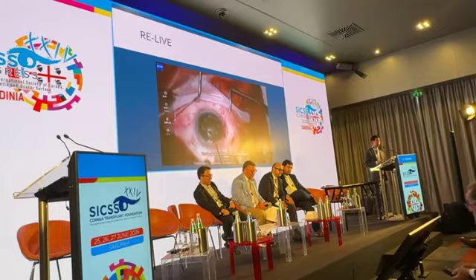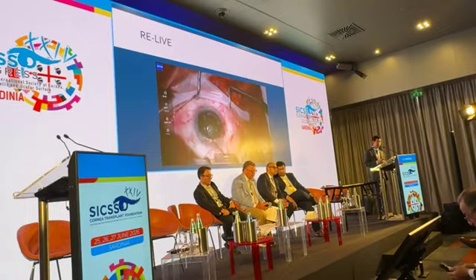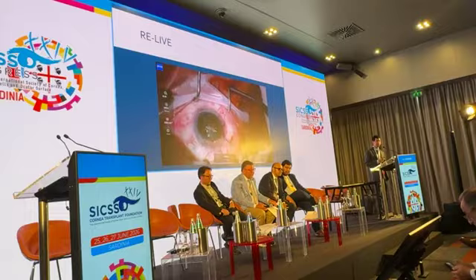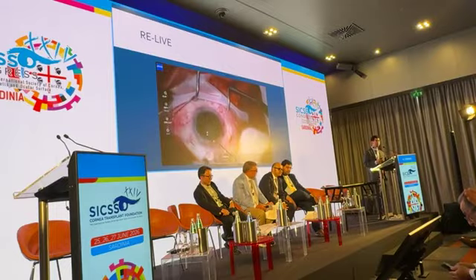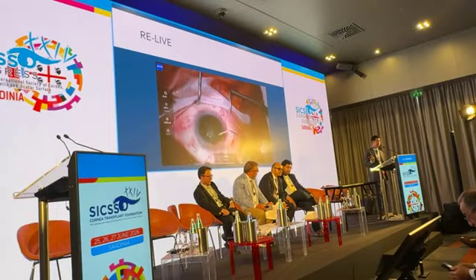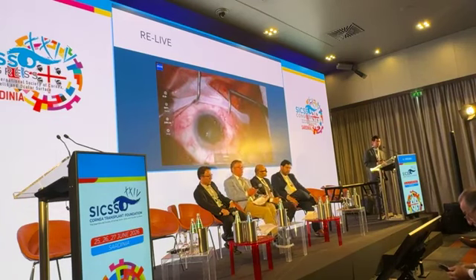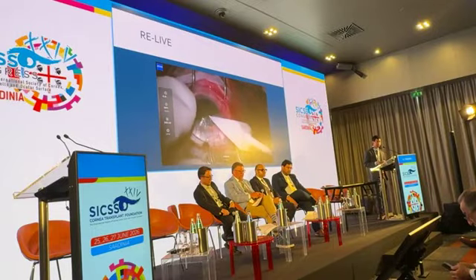Agreed. Most of my concentrate is tissue glue along the edges, so I put that at the beginning and I'll smear it into the middle. And I'll use the fibrin, and then put a bandage contact lens afterwards. Sometimes it's so adherent. At the beginning, I didn't even put the fibrin glue in a couple cases, and it remained nicely in place and epithelialized over. But then hearing some colleagues have that issue where it gets sloughed, I went back to doing the glue and the whole 9 yards there. So once it's in place, another 5 minutes of drying, then the bandage contact lens, and then the case is done.